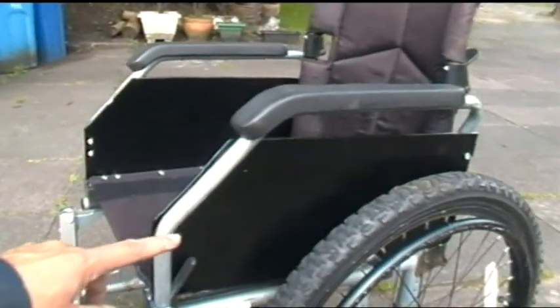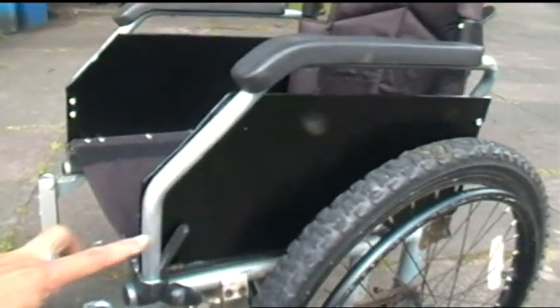I've changed the plastic sides which were in there and broken to aluminium ones and painted them black. This is the original pair lying on the floor down here. You can see the wheel had been rubbing on them at various points and the ends had snapped off, and they didn't give good protection to the person sitting in the chair. They weren't tall enough.